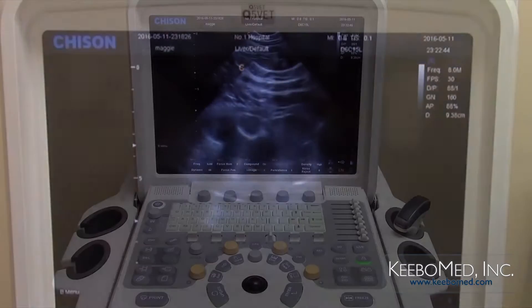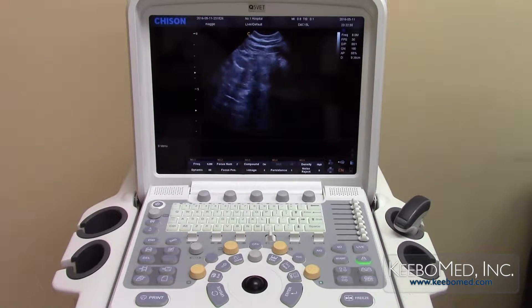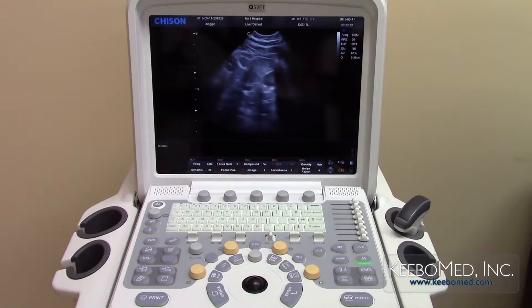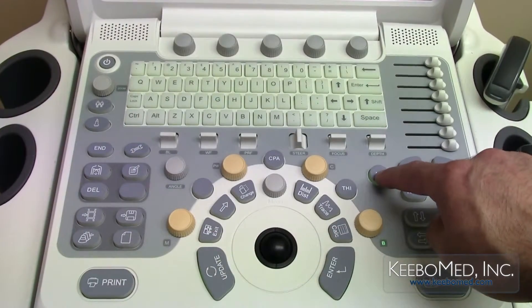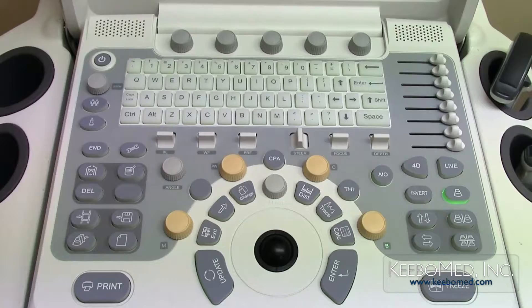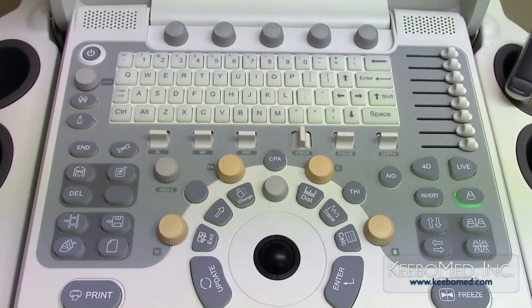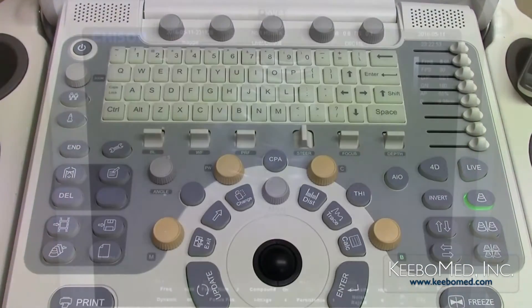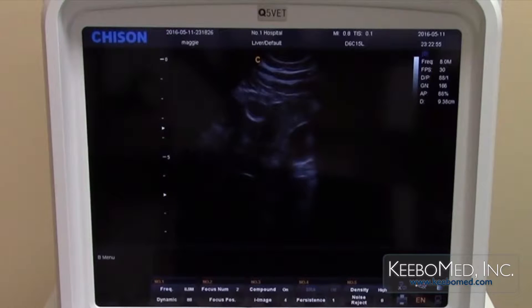Number 5: if the TGC or total gain needs to be reset, press the AIO button — the automatic image optimization button — located below the depth button. The total gain of the image will be automatically reset to the default settings.